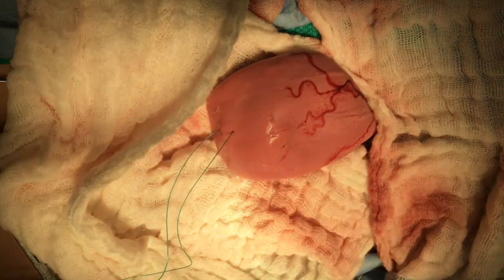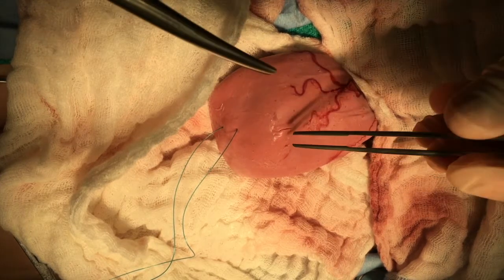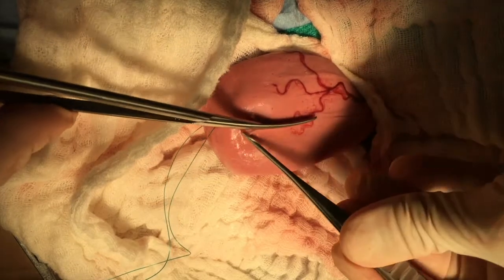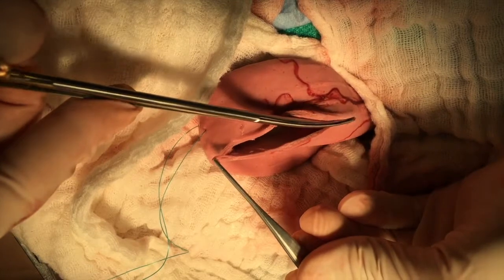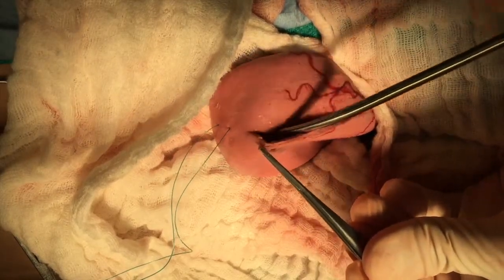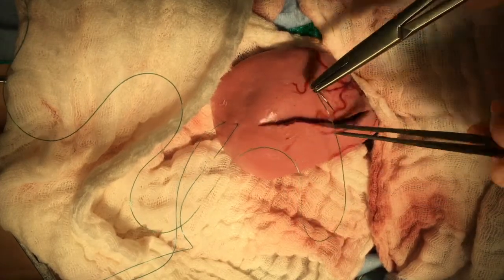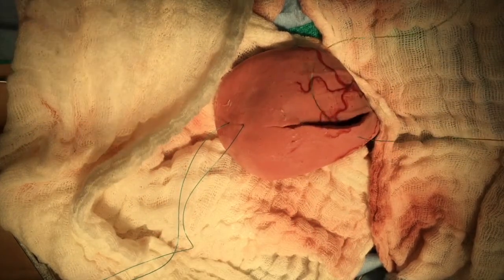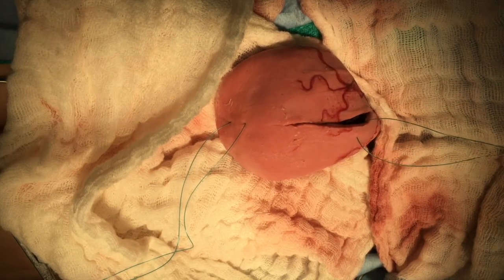A stab incision is made on the ventral aspect of the bladder. This stab incision is then enlarged with Metzenbaum scissors. Do not be shy with the size of this cystotomy — it must be large enough to remove all the stones inside and inspect the lumen. Additional stay sutures are placed at the margins of the incision.